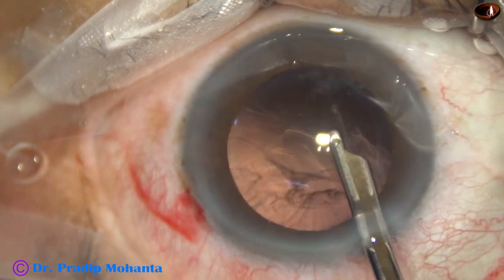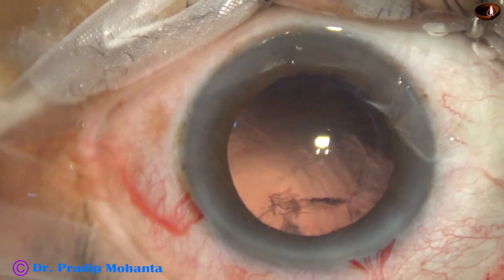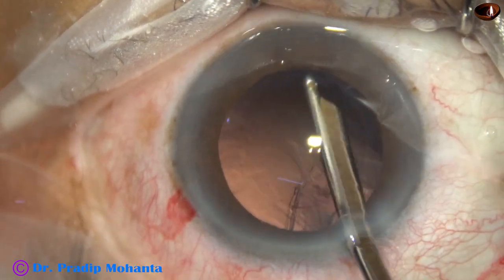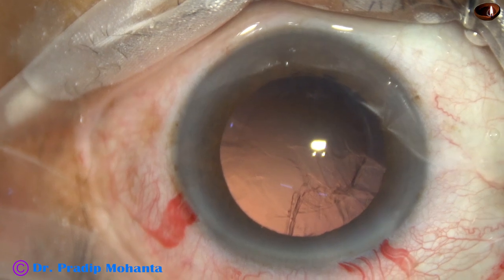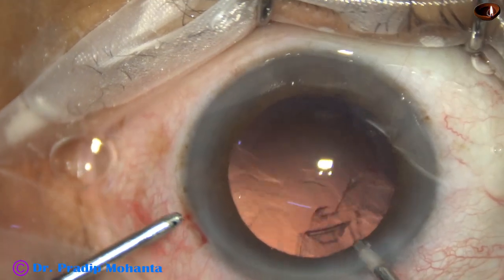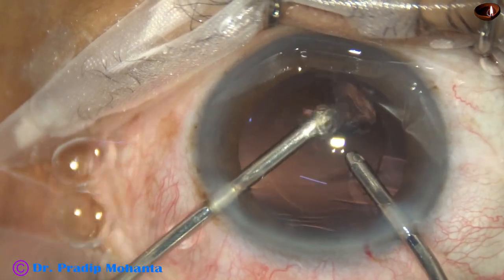This pre-chopper has been designed by Dr. Sohail Irfan Khan from Nanded, Maharashtra. I have no financial interest in the product, but I find this instrument very useful in soft cataracts. Dr. Sohail uses this for all kinds of cataracts. I use it only for soft cataracts, because in harder cataracts I can easily hold the nuclear mass and chop it.